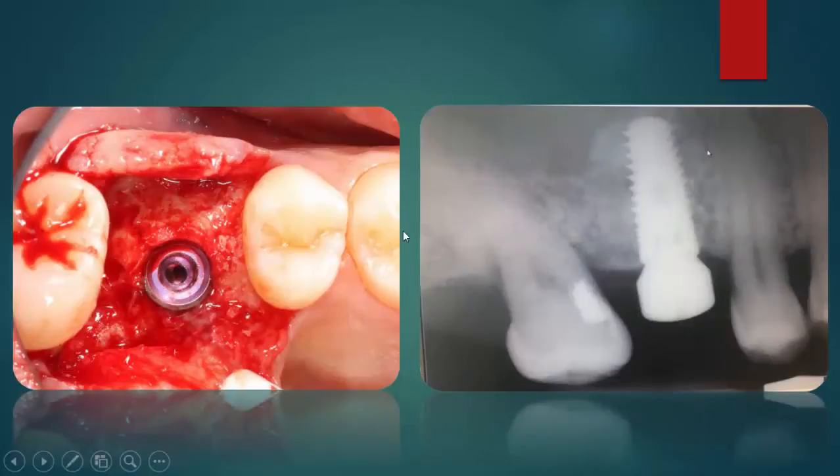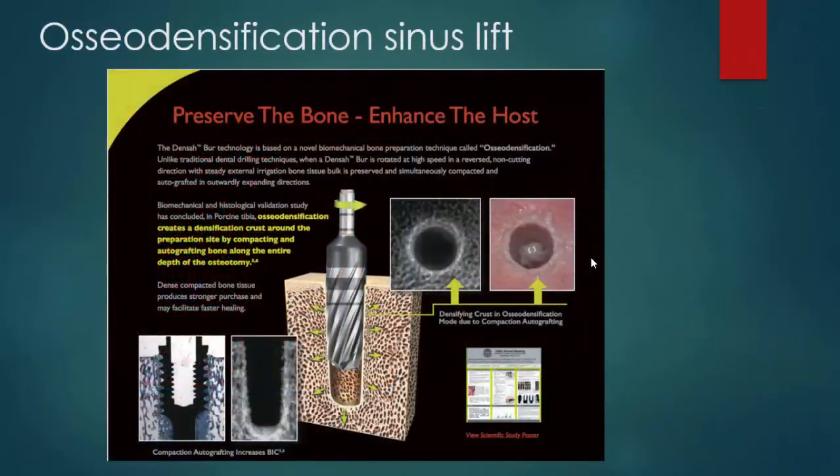This is clinical photo at the implant placement, and this is the X-ray 6 months post-operative. نلاحظ إنه الزرعة لساتها محاطة بالطعم العظمي. هلا بالنسبة للأوسيو-densification sinus lift. This is a new system.